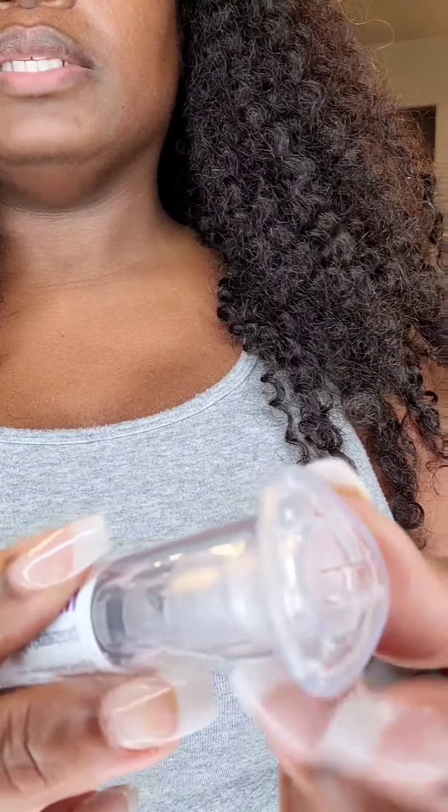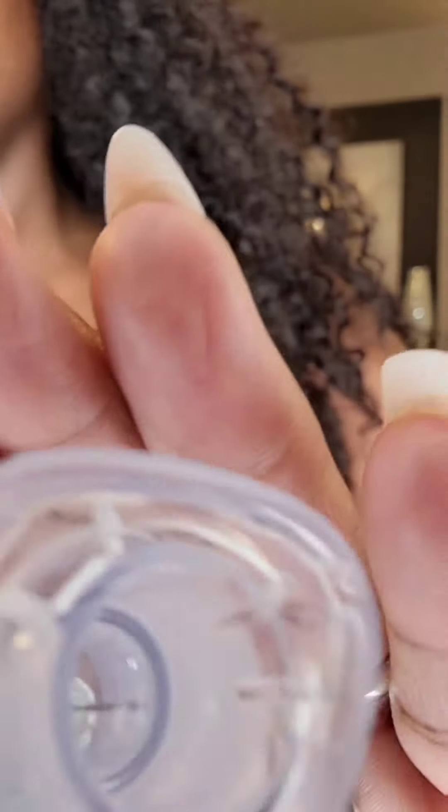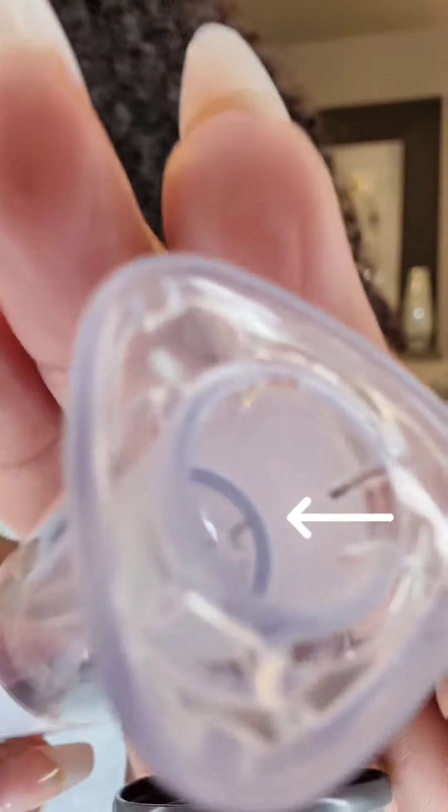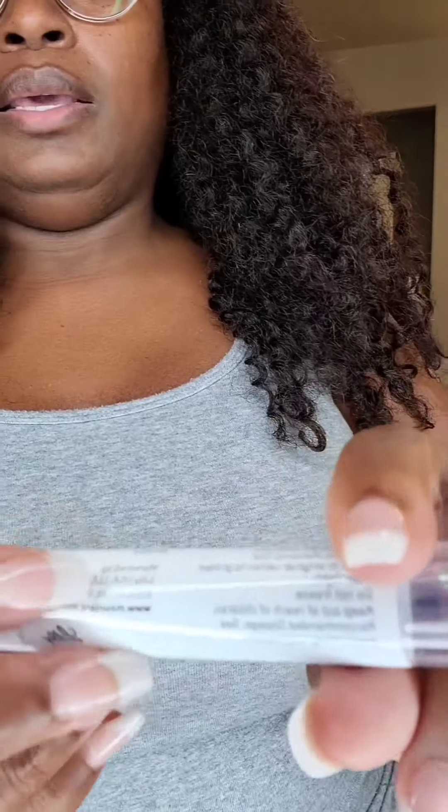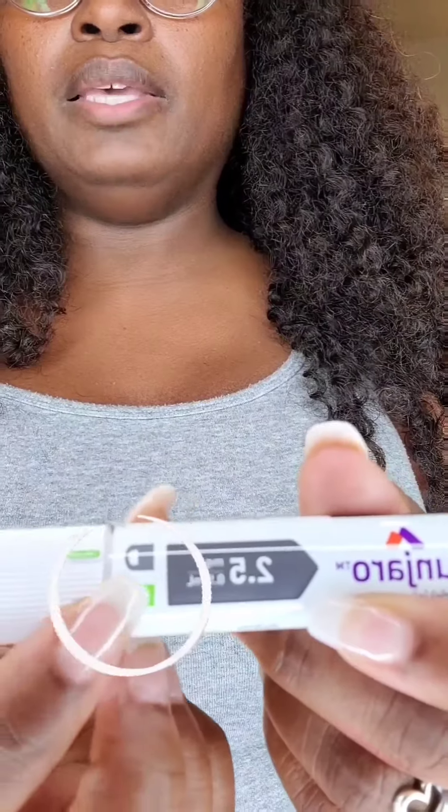This is the needle on this side, so we're going to uncap the needle. You can see the needle is in there if you guys can see it — yeah, the needle is in there.